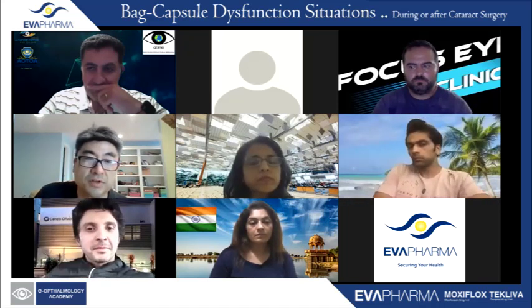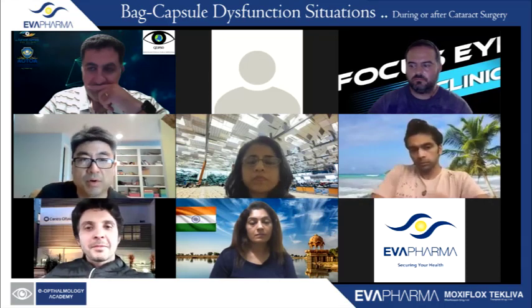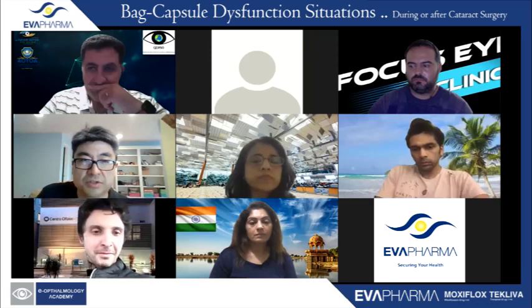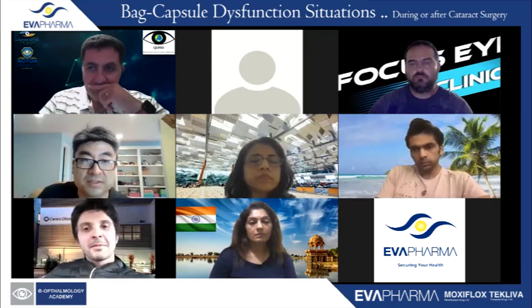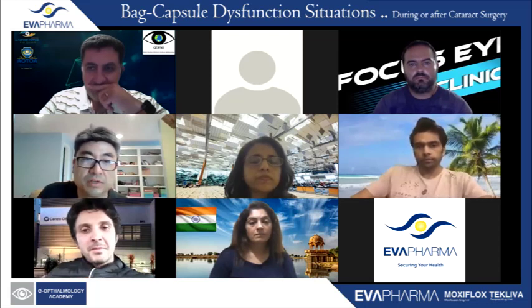And also you can feel more confident that, if you are not skilled or mess up in the process of the surgery, you're not going to lose the lens because you have some level of support. So I think it's a great transition technique for people who are learning.